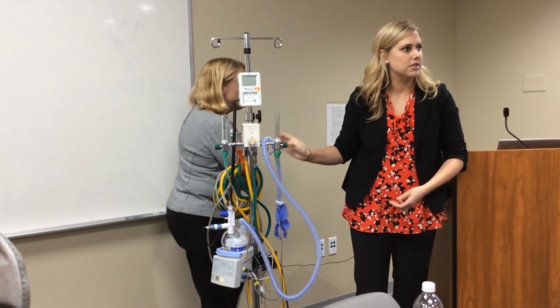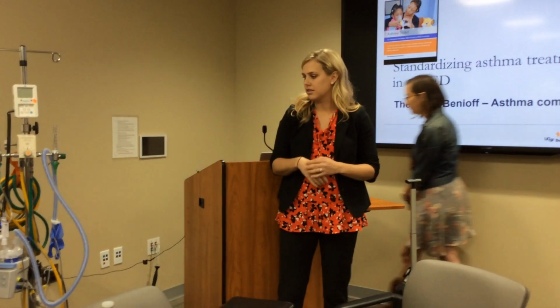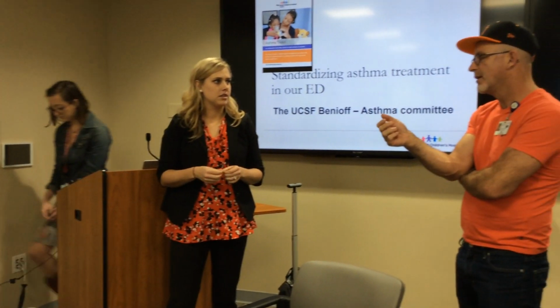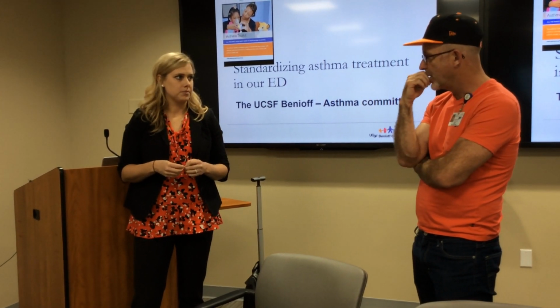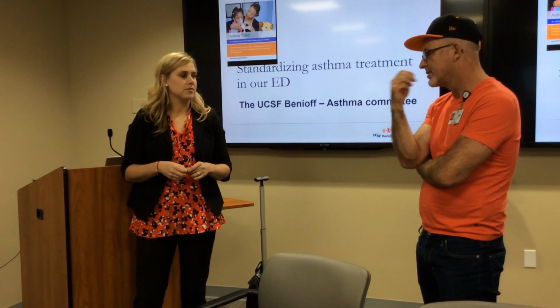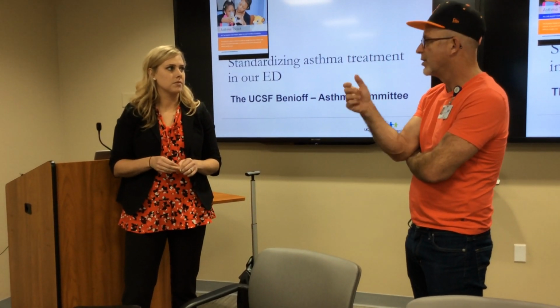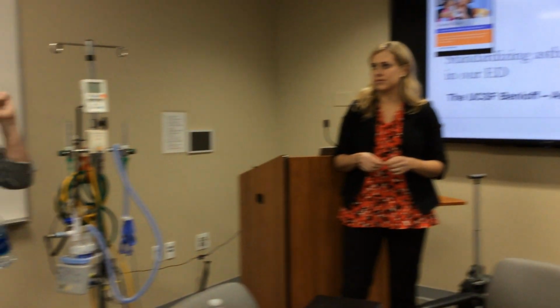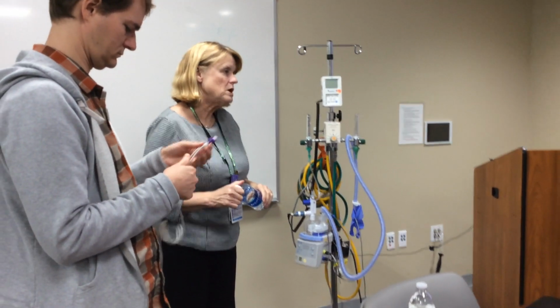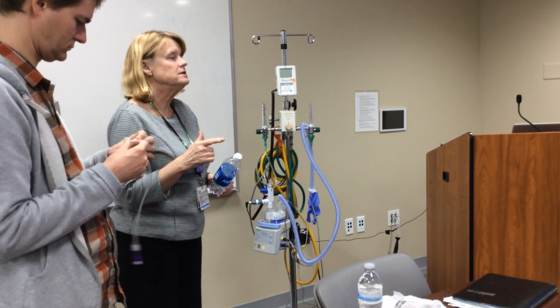What other questions? Maybe you covered this and I was not here. When you kick the rate up to 8 liters, does that change the percentage? I know there's a mixer there, so what I'm gathering is each time you increase it up to 6, 7, or 8, that will increase the FiO2, is that true? It depends. You said if they're not doing well, you increase it up to 8, but we never go past 50%. But remember, why are we increasing the liter flow?